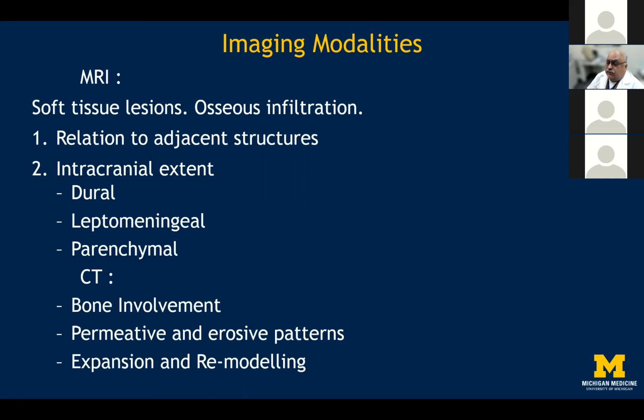And if you have that in mind and you know the anatomy very well, you can easily trace out the pathology based on very typical radiological features of those lesions. So this forms the basis. The entire basis of head and neck, that's the crux of this approach to looking at the diagnosis of head and neck lesions on imaging.